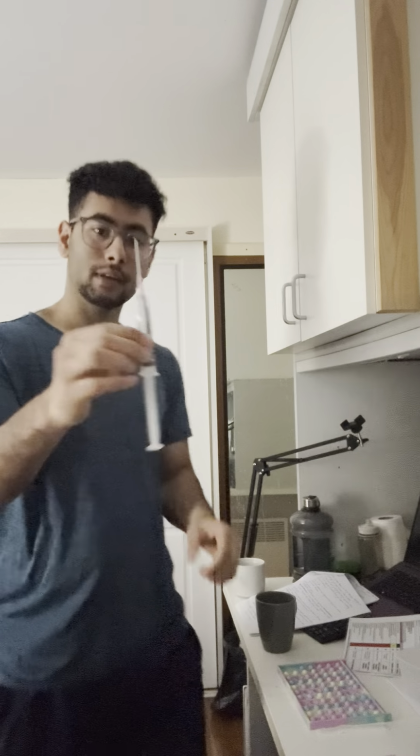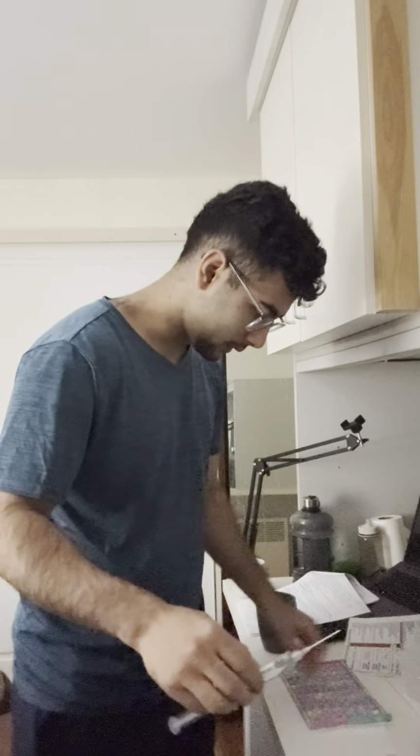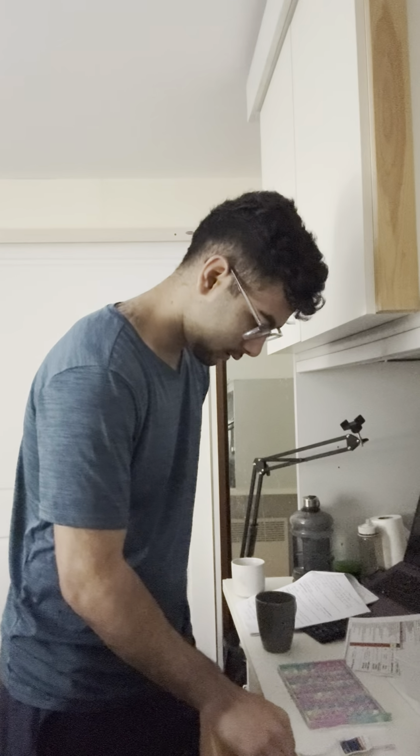Cool. So as you can see, it's 10 ml. Now I'm gonna put it back. Never recap like this, as I have said multiple times. Always recap like this, right?